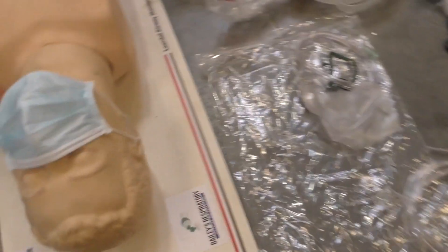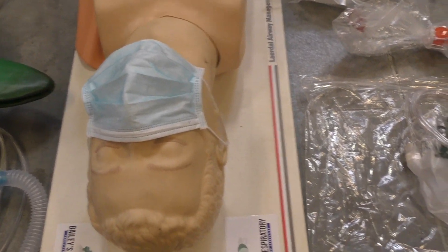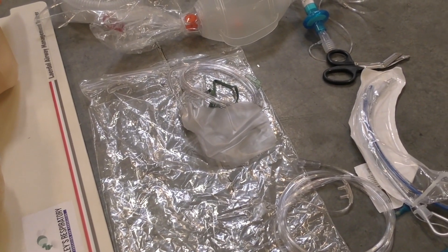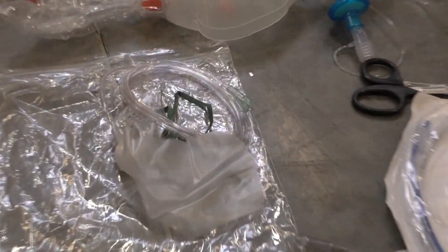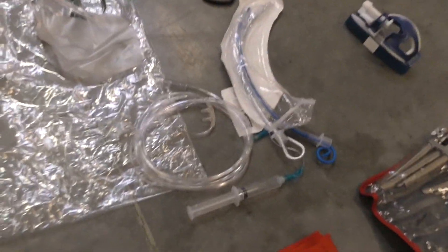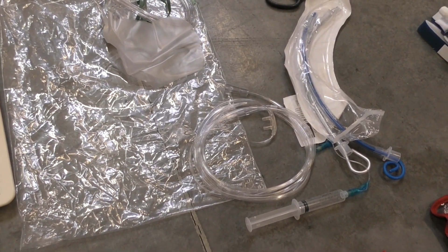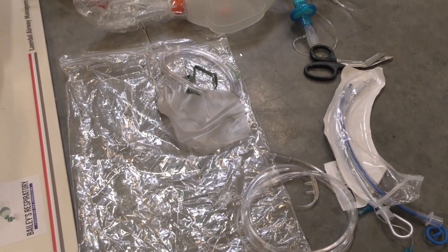With this patient, we want to avoid spreading any kind of droplets. We're going to try to minimize bagging as much as possible — we're not going to use the Ambu bag if we don't have to. If they're not oxygenating well, we'll put them on a non-rebreather. If they're doing okay, we'll put them on nasal cannula at six liters. We're not going to put it at 15 liters because we don't want to create high-flow issues and spread the virus.